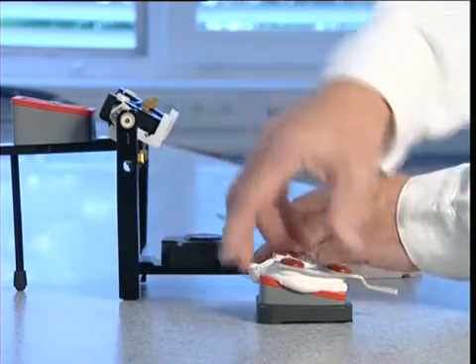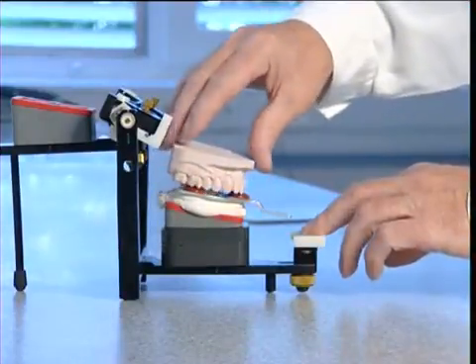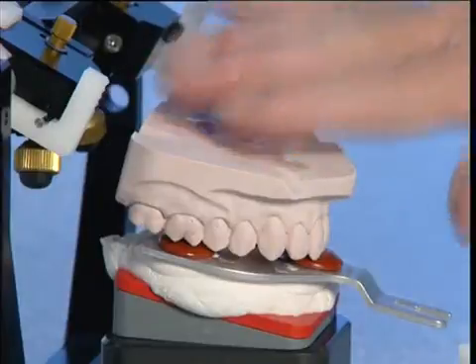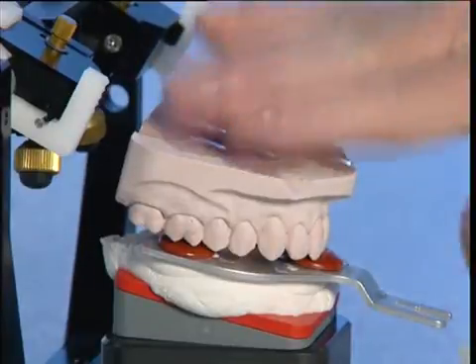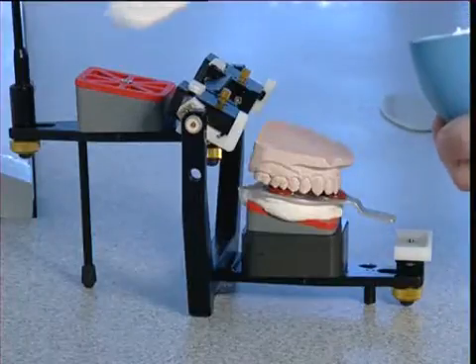Once the plaster key has set, it is placed on the lower member of the articulator in the laboratory. The upper model is placed in the indentations in the bite fork, and the model platform and moistened model coated with soft articulating plaster.